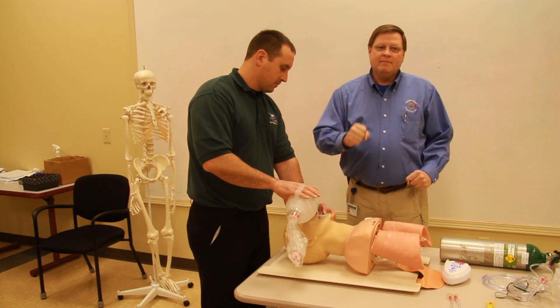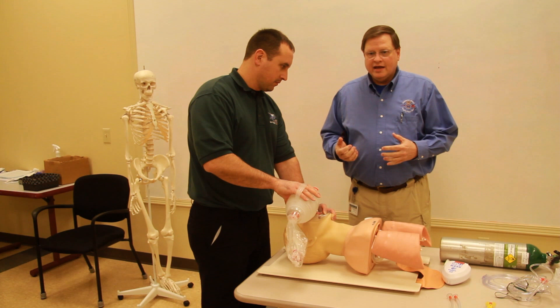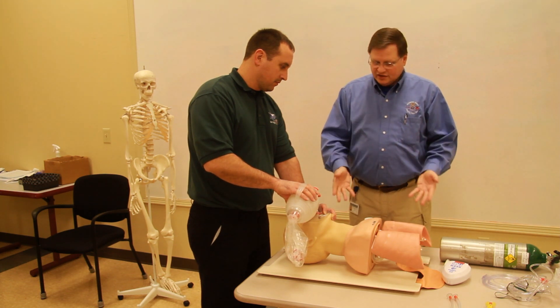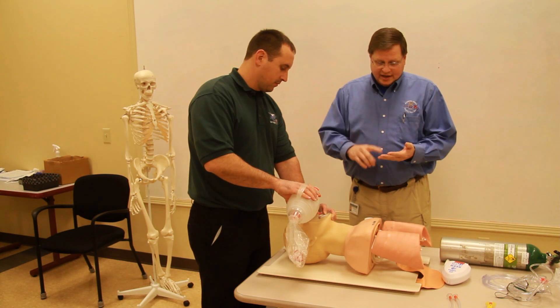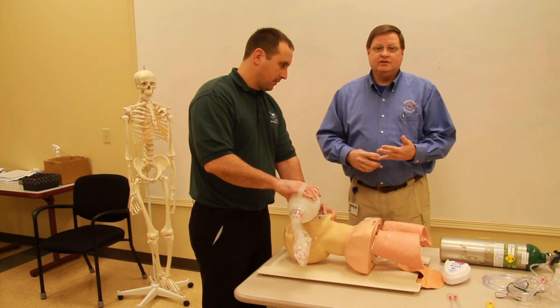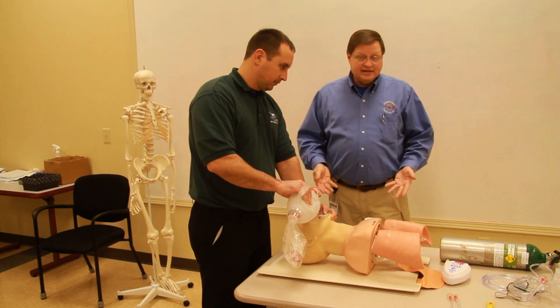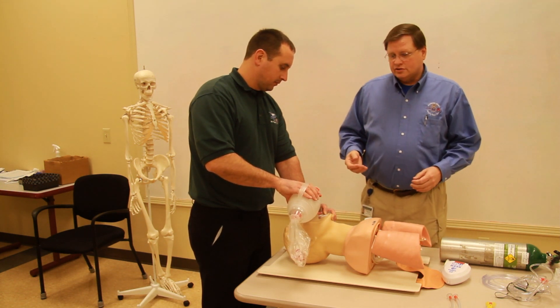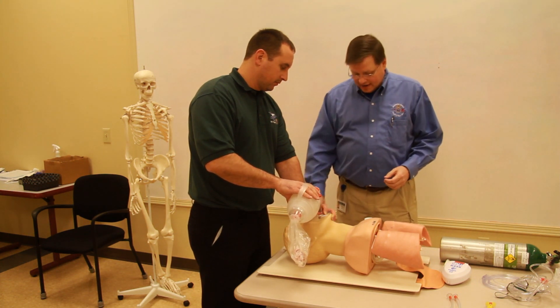I say: 'Med Center, this is Medic One, and I need orders for a PTL. I have a 50-year-old male patient who is not breathing.' This tells them the age is correct and that he's not breathing and therefore unconscious. I get confirmation to place the airway.